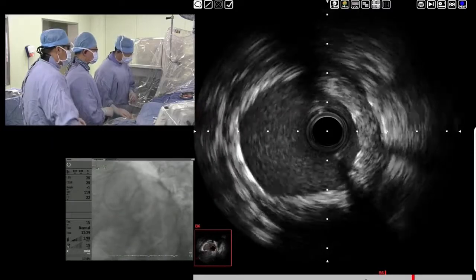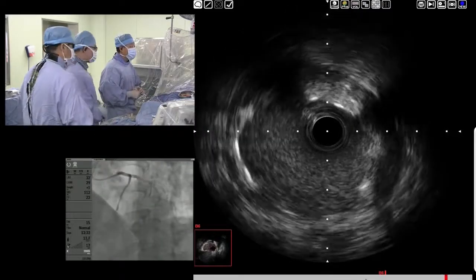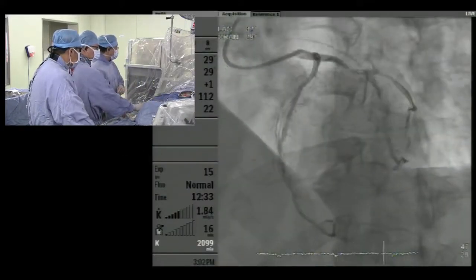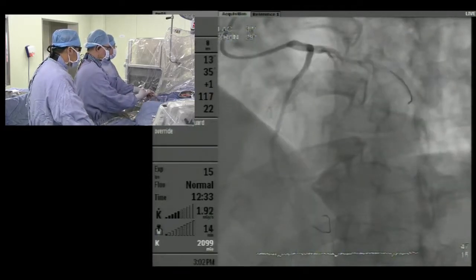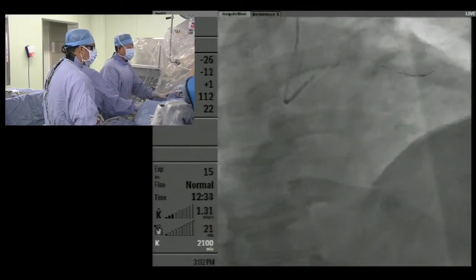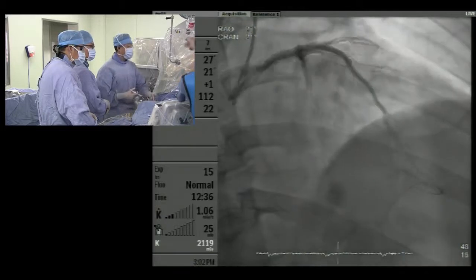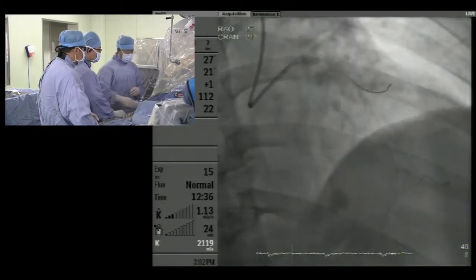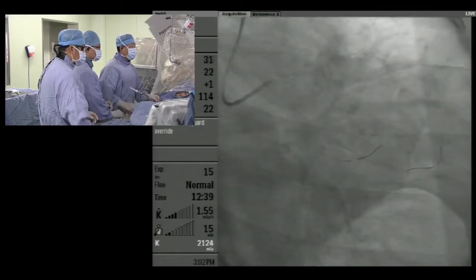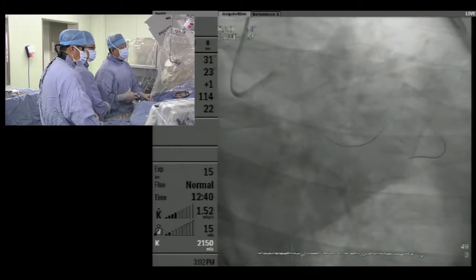With the angiogram, several projections. This is the caudal cranial view. Look at that, the left main stenting looks a little bit oversized. That means it is very well apposed. If it looks similar or undersized, that means not so well for apposition. Now here, look at that, a little bit oversized, that's what I want. That means well apposed angiographically. If not so oversized, I'm really concerned about the apposition. Yeah, that's almost all.